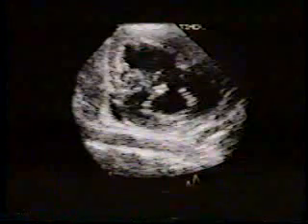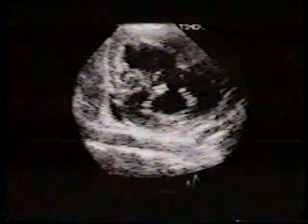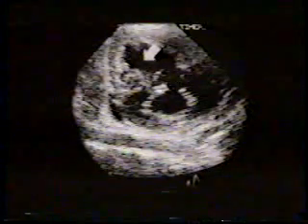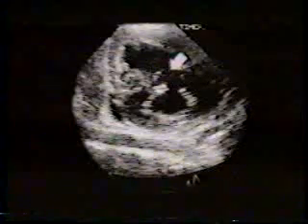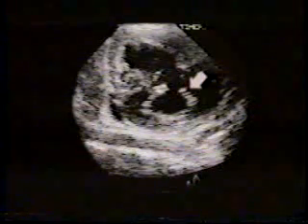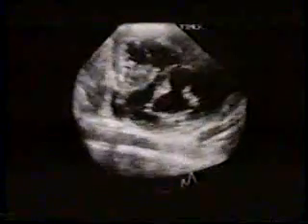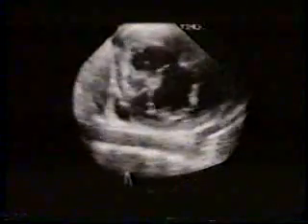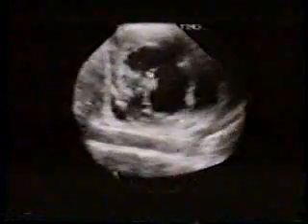This is the parasternal short axis view of a 22-year-old patient with complete atrioventricular canal defect. This is right ventricle, large inflow ventricular septal defect, and the mitral leaflets are seen here. Observe these characteristic features in real time. Attachment of these leaflets to the crest of the ventricular septum is also clearly seen.